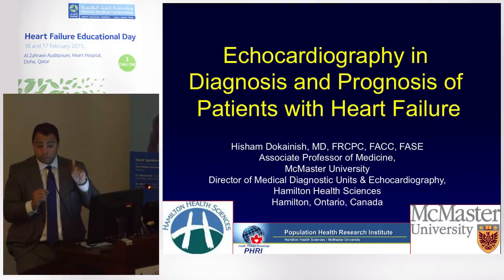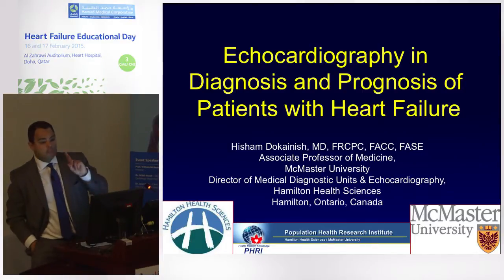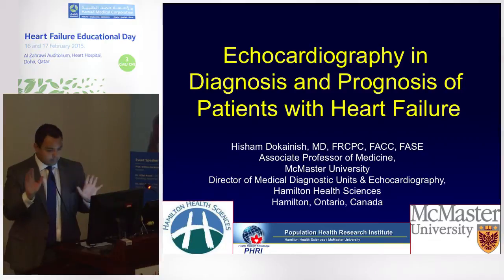We do it only in research, but we routinely clinically measure global longitudinal strain, which is easily done, and then we look also at the diastolic strain. So what I would do is this. We commonly get this question: a 40-year-old patient, 30-year-old patient, with a very strong family history of hypertrophic cardiomyopathy. Is this patient genotypically possibly positive but phenotypically negative? So we do an assessment with the echo, we measure the tissue Doppler, and if the strain, systolic and diastolic, is plumb normal, it is unlikely, not impossible, that they have a subclinical variant of HCM.